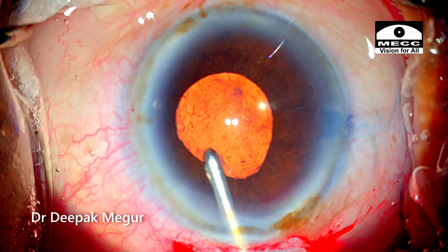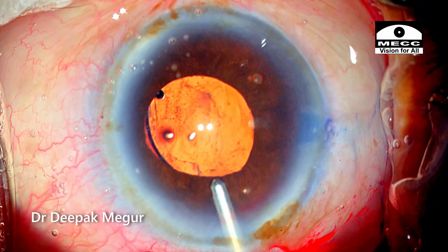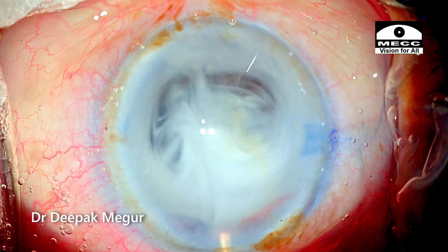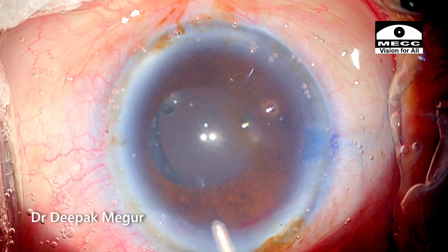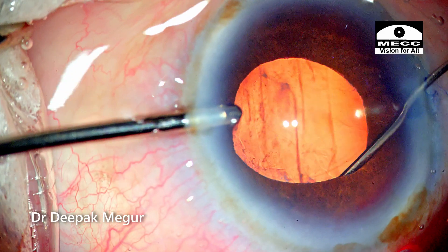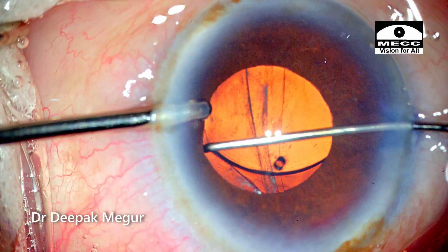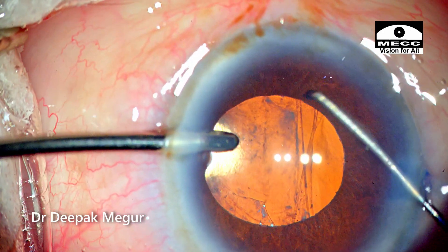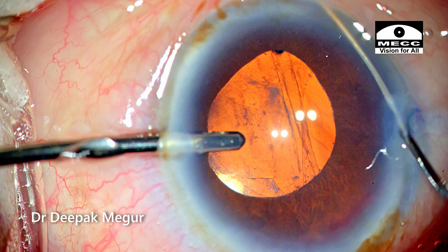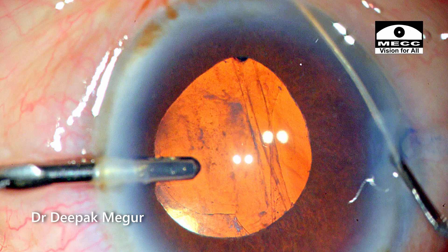Time to remove the OVD. As it is being done, I see the lens is being decentered slightly. I use diluted Triamcinolone Acetonide to check for any prolapse of vitreous — thankfully there is none. With the irrigation handpiece in my left hand, a Sinski hook is used to dial the lens one more time, and now it seems to have centered well. These striations on the posterior capsule are perpendicular to the axis of the haptics — there are too many of them.